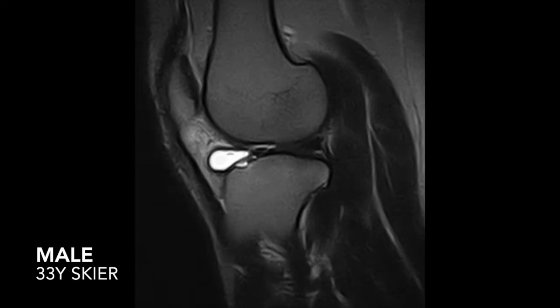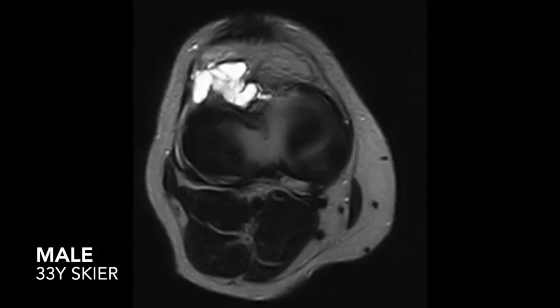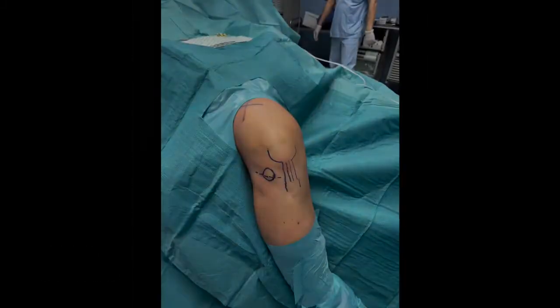A 33-year-old man suffered a knee injury while skiing. The MRI of the knee shows a considerable anterolateral parameniscal cyst.